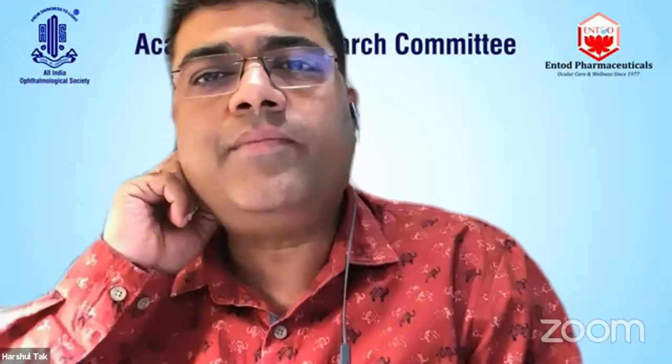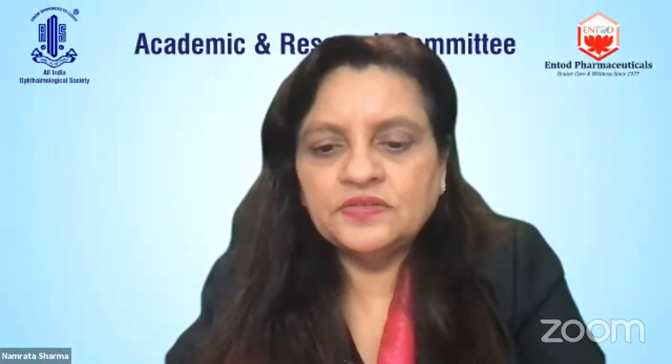So one more question is there. I think Dr. Rohit can answer this question. Tips for phaco in soft sticky cataract in mid-dilated pupil in diabetic patients. So Dr. Naresh Rohra is asking this question on our panel, sir. Dr. Rohit, are you there? Dr. Sandeep, you can answer that, please. Tips for removing? Sorry, I wasn't attentive. Tips for phaco in soft sticky cataract in mid-dilated pupil in diabetic patients.